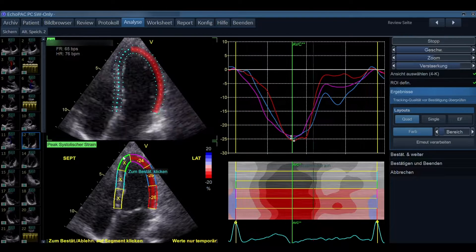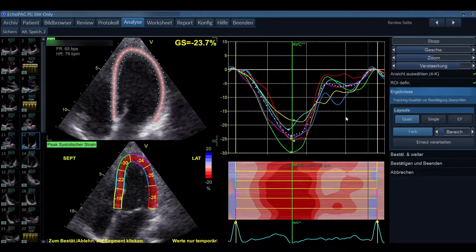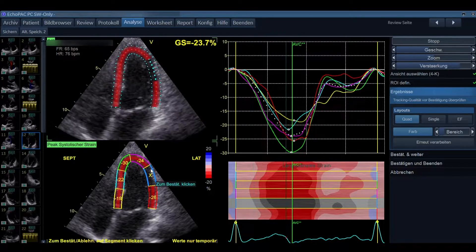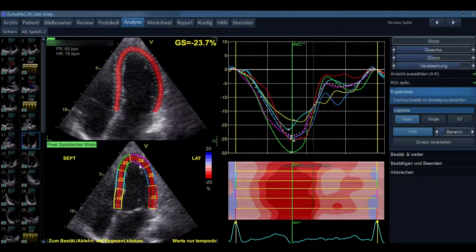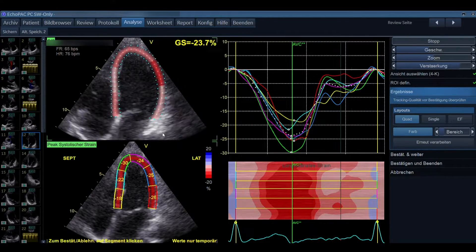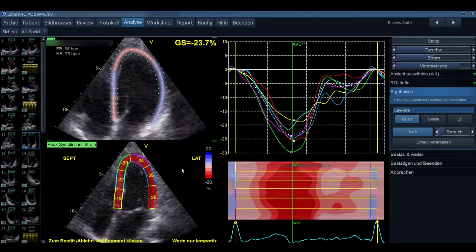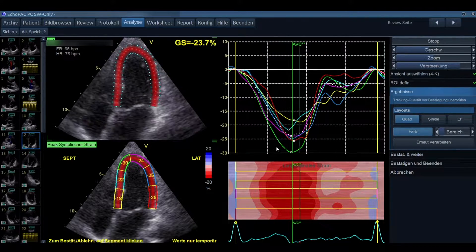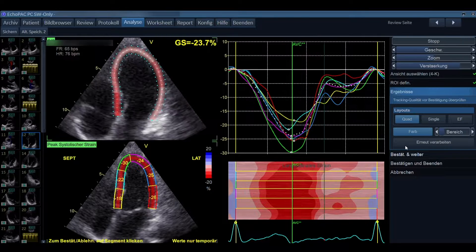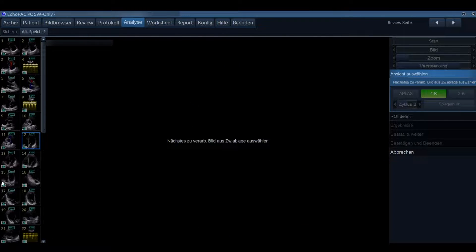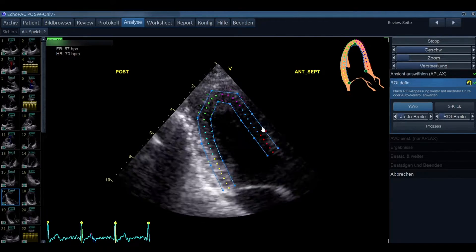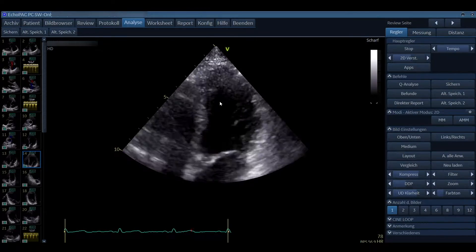If you delete one curve it turns gray, meaning it is not taken into account. You can do this for each individual segment. Overall, if two segments are not being tracked, that is borderline — ideally all segments are traced nicely. If one segment isn't tracing well but can still be used for diagnostics, you can continue with the next views: the two chamber view and the three chamber view.